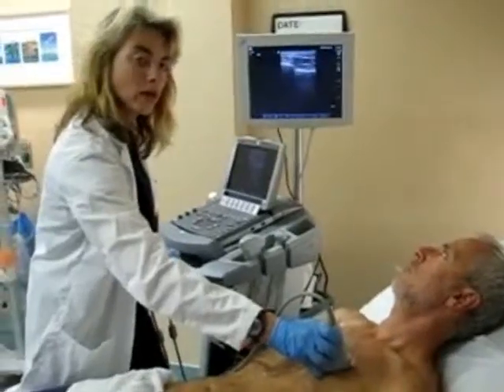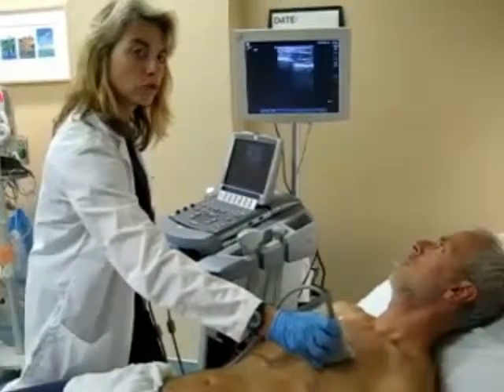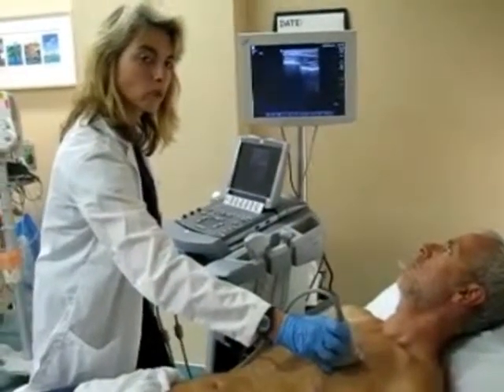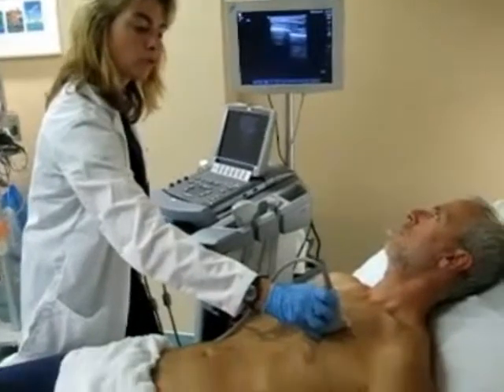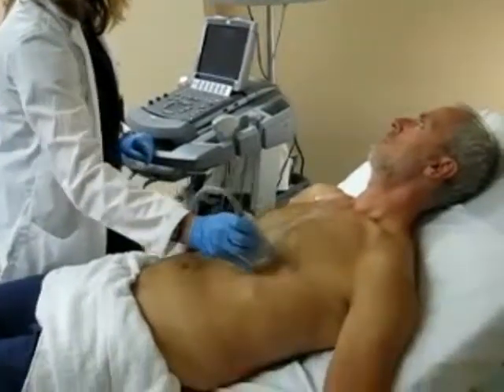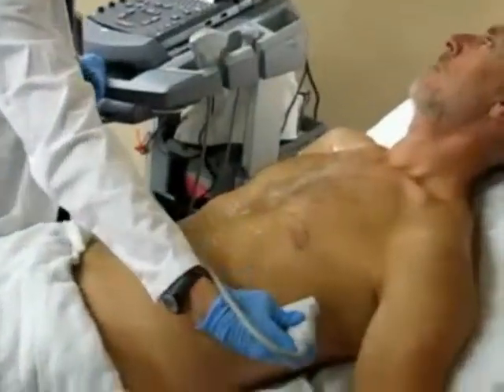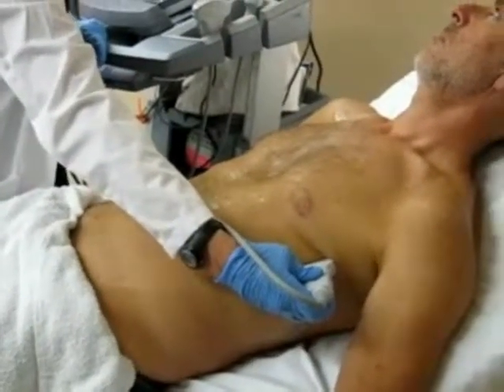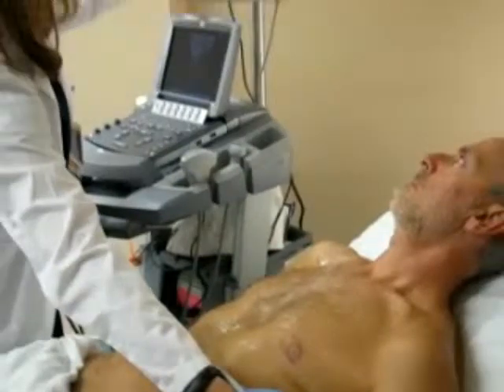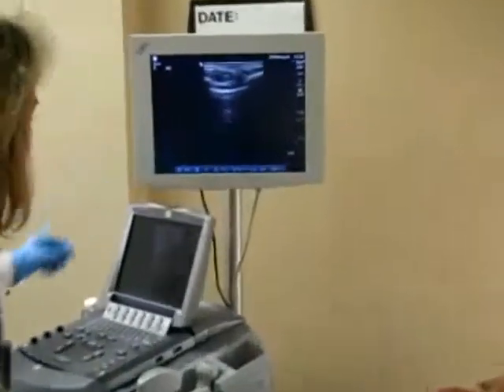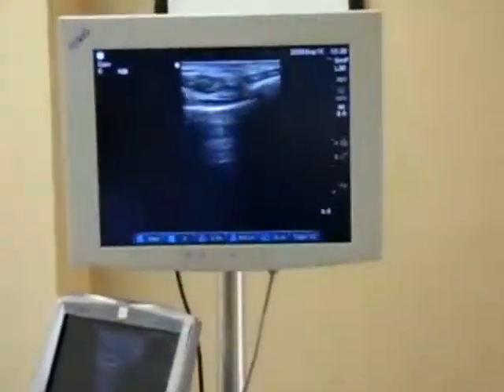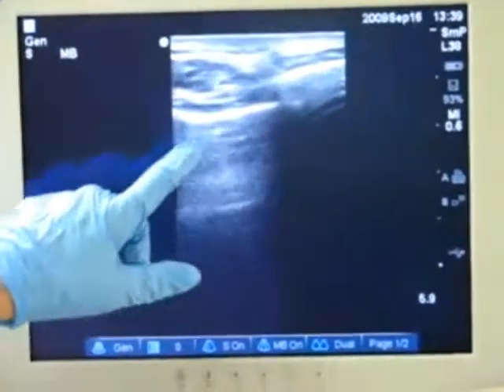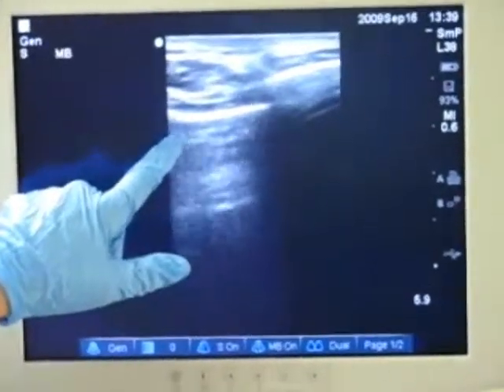In a situation where you have a higher level of suspicion for pneumothorax, you should evaluate the chest in more than one location — you should move your probe down the chest wall and out laterally, checking in each of these locations for the presence of lung sliding and comet tailing, as can be seen here on the screen. Moving laterally, again you see lung sliding and comet tailing.